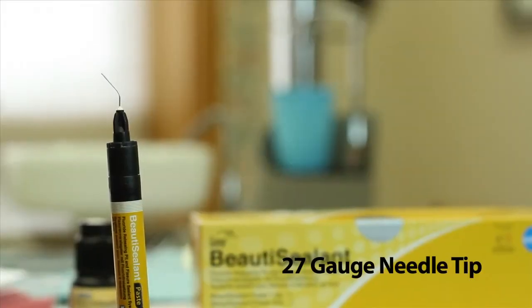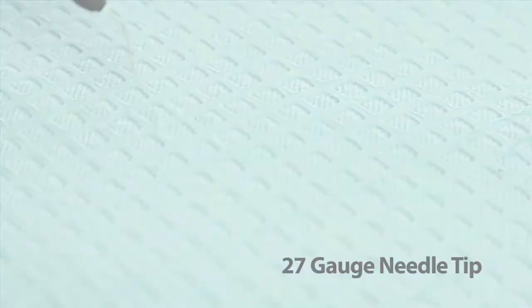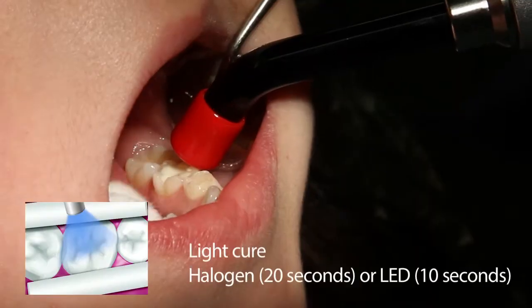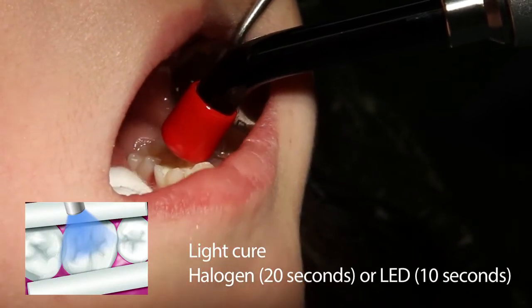Also note the small needle tip. This allows you to get into the pits and fissures easily. Finally, light cure the sealant. If you're using a halogen light, cure for 20 seconds. For an LED light, cure for 10 seconds.